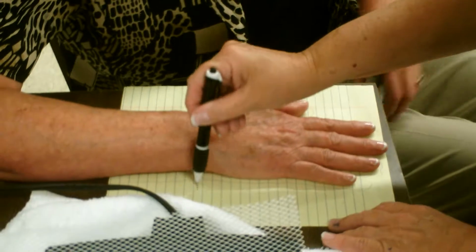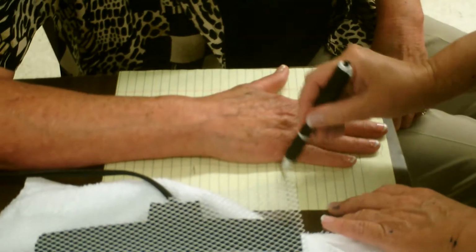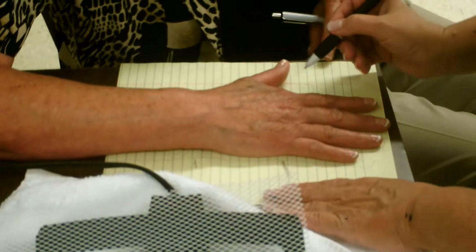Before they lift up, you mark it, mark the styloid, mark the distal palmar crease, and then we're going to do a connect the dots. So you lift up, splint comes here, you make a little thumb bar, I don't know what you call that.